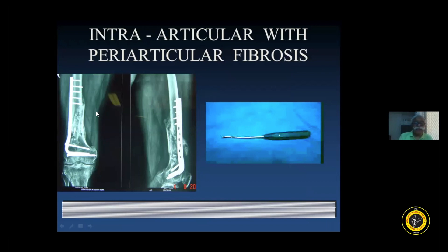For cases such as lower femoral fractures and intraarticular fractures, the scarring is not only intraarticular. The intraarticular part is released first, and once this area has been released, we move the arthroscope all the way up into the thigh. For releasing this scar tissue, a 3.5 millimeter periosteum elevator introduced through a portal in the thigh is a very good method to release the adherent musculature from the femur. In this procedure, we also see there is a bony ridge across which the quadriceps is stretched. We release the adherent quadriceps from this under arthroscopic vision, cutting all the way up.